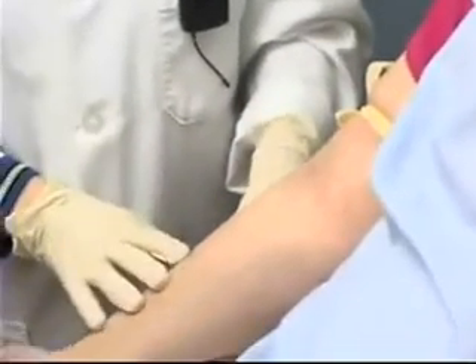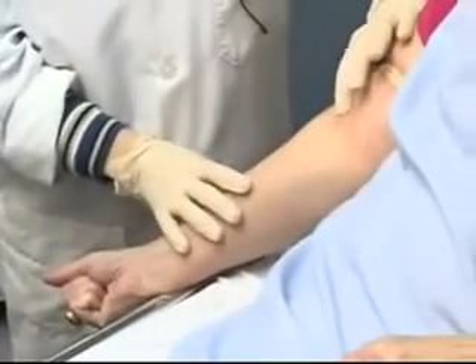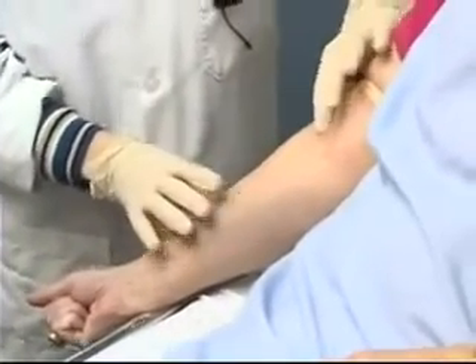I'm going to ask my patient if she'd please make a tight fist for me. I'm going to feel the area and I can feel that vein — nice there.